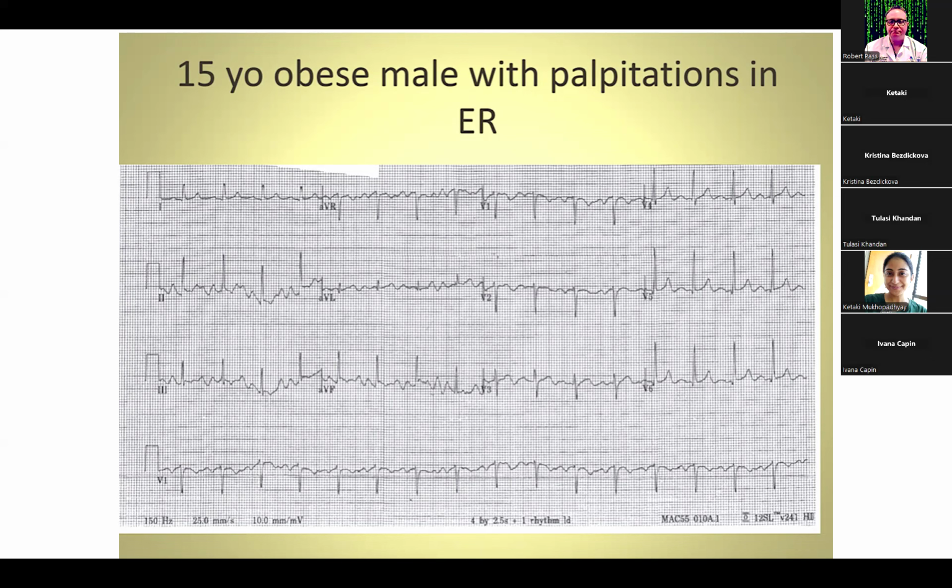Right. So can you be in sinus rhythm in 5 leads, but not in the rest of them? No, no. So what do you think this is, though? Is this artifact? Correct. This is artifact. Now, it's conceivable that people can have AFib in their left atrium and be in sinus rhythm in their right, but that's extremely unusual. Certainly in pediatrics, it is. So you want to look to see whether you can tell in any of the leads more clearly.